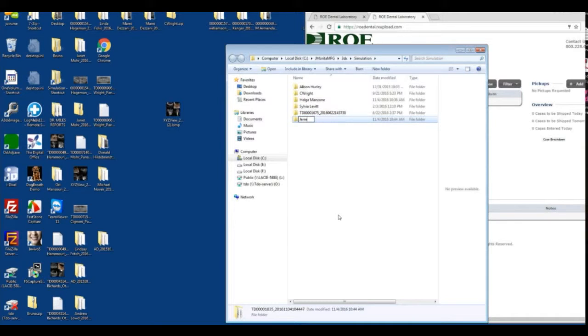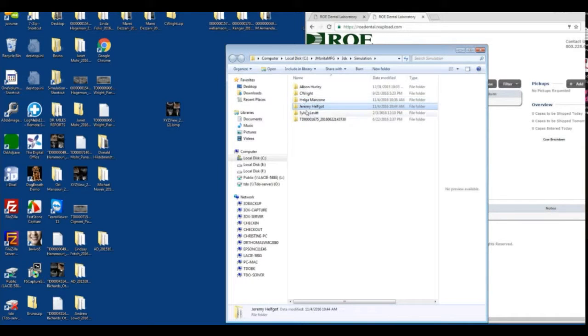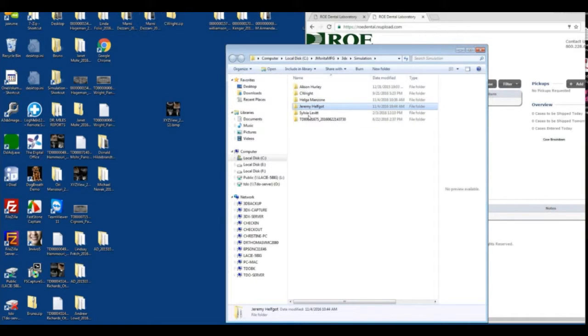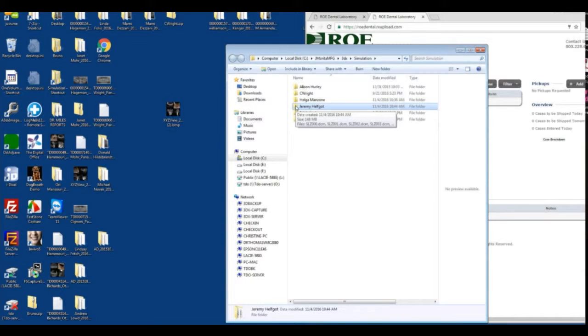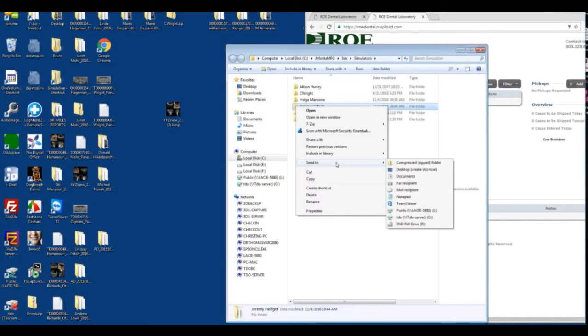Locate the folder and then rename it to the patient's name. Then you'll want to right click, send to compressed zipped folder. When we're in here, this is where we right click, send to compressed zipped folder.